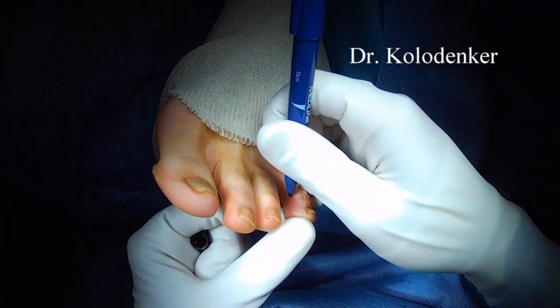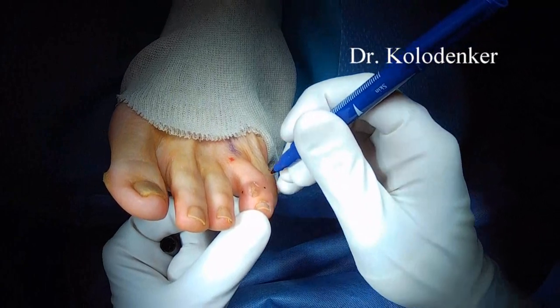Hi, this is Dr. Kolodenker, and I'll go over how to excise a mucoid cyst.